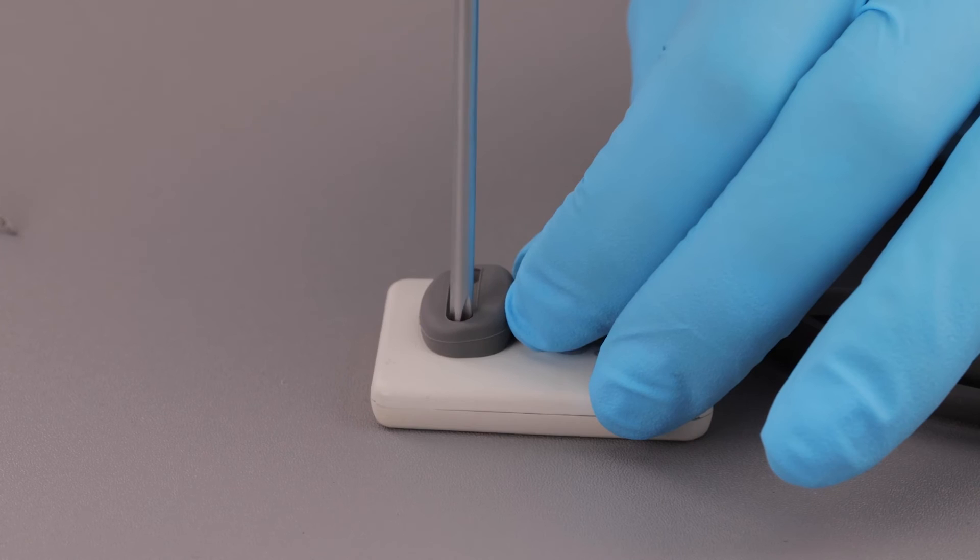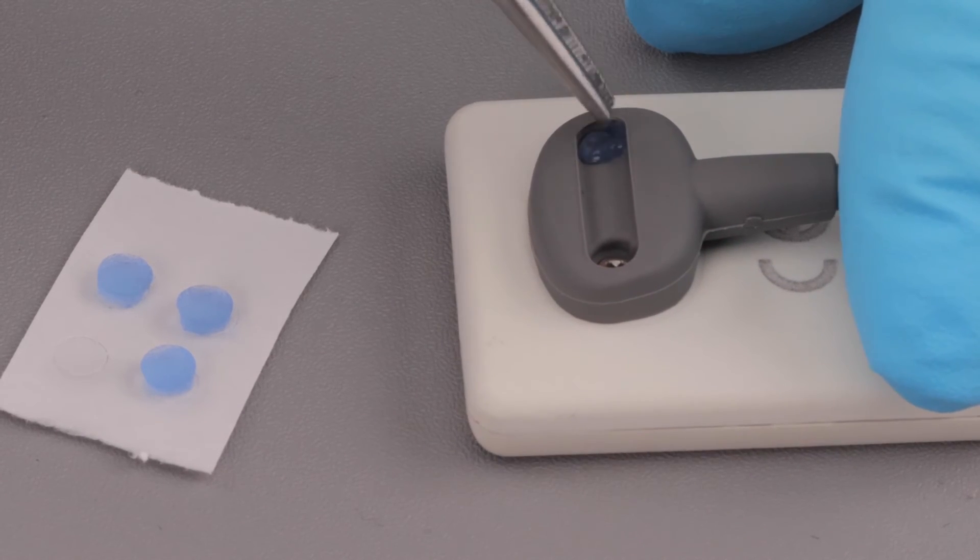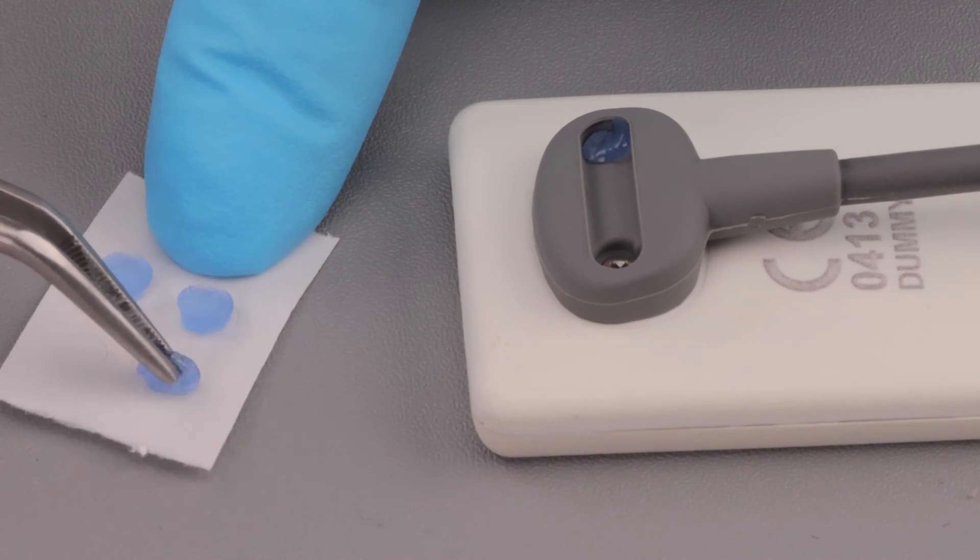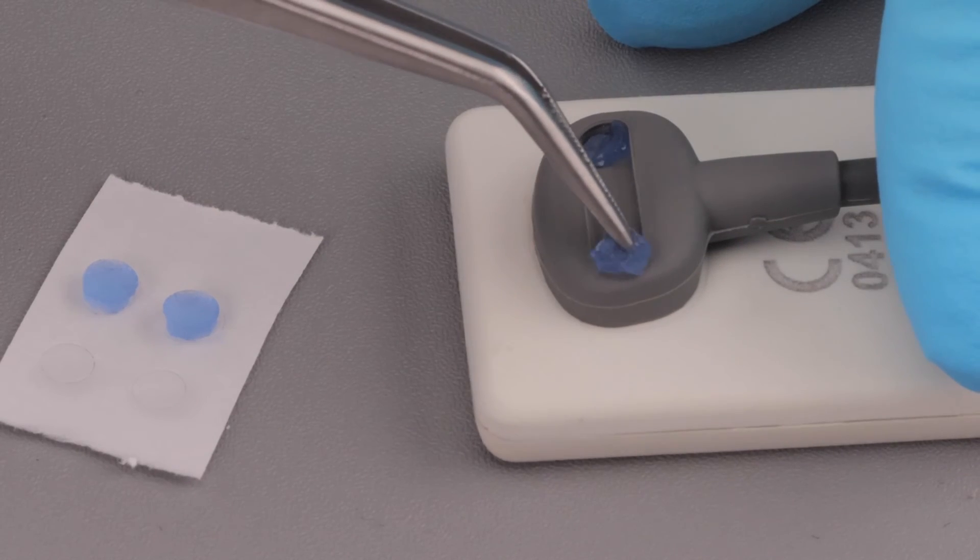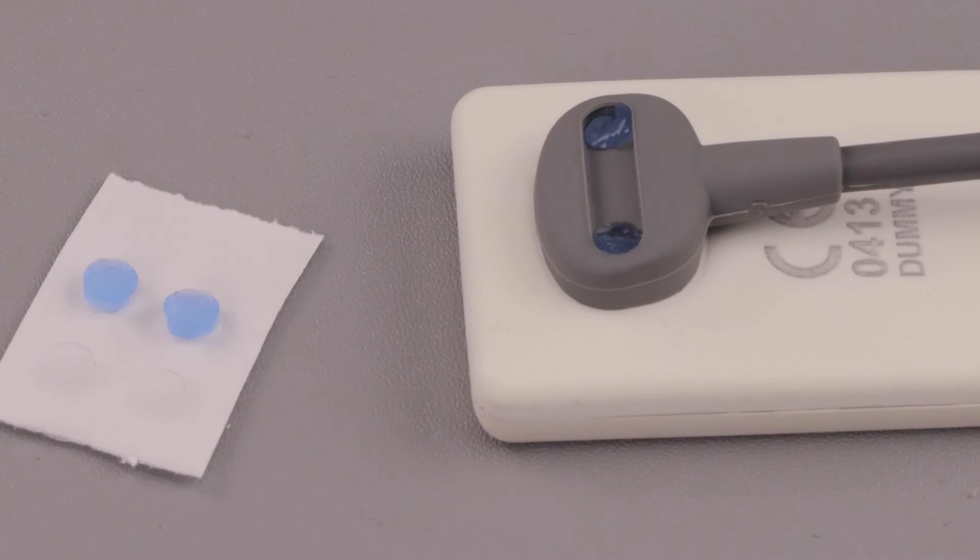Using tweezers, remove a gel disc from its paper backing and place it over one of the screws you just tightened. Make sure that the gel material completely covers the screw. Remove another gel disc and repeat this action for the second screw.